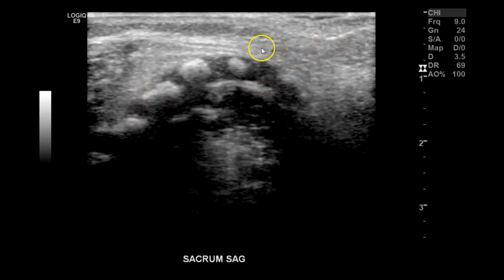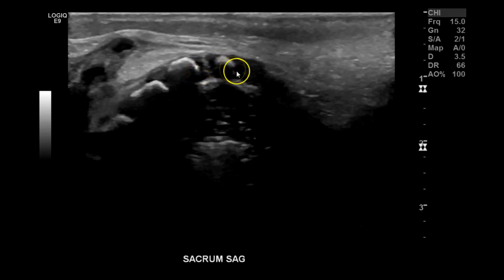For starters, I began with a 9 MHz transducer — you can see it's kind of grainy. I went with the 9 first, but then I switched over to the 15, and you can see it's much better.